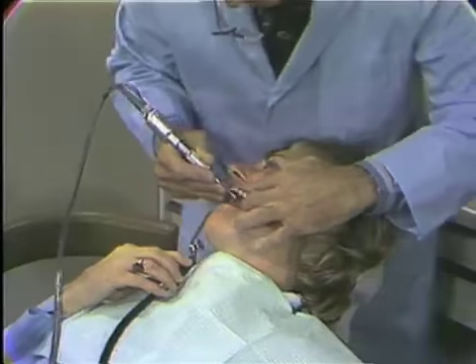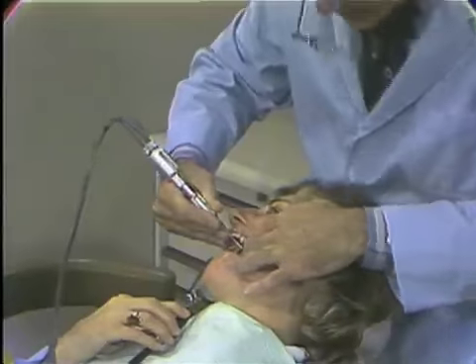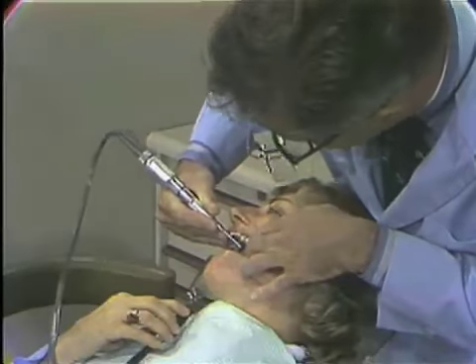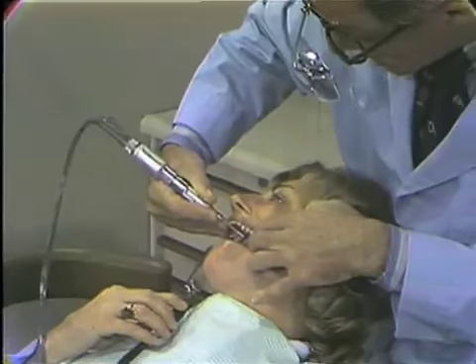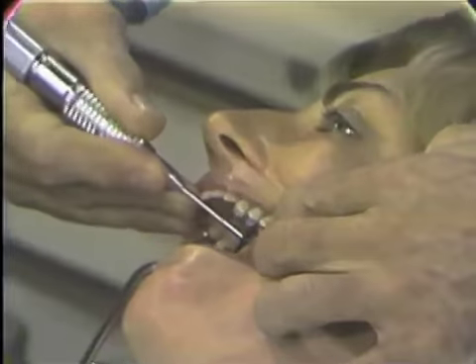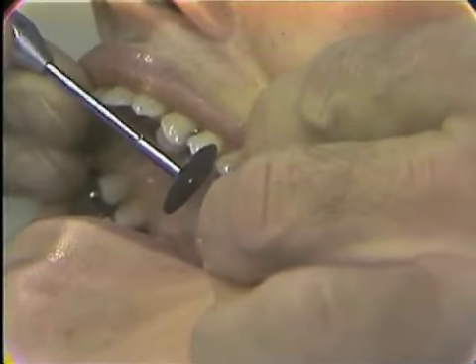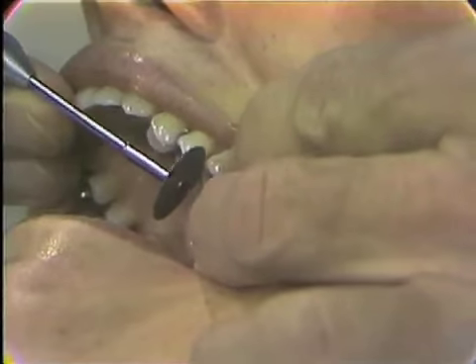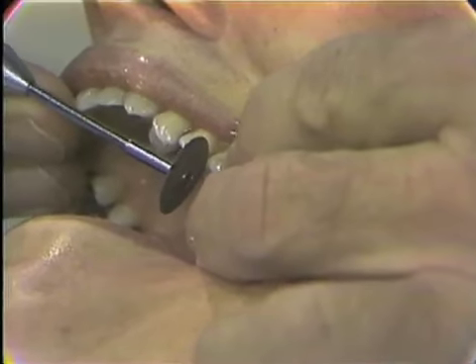Now the lingual is much the same, except we have to bend a little more, and we will look in here and place it and come a little more to the left, holding the position. Now I am again looking in, and I think a tight shot here might show that for us. But I'm looking between the tooth and the disc. So we then notice too that this mandrel is below the surfaces of the anterior teeth.